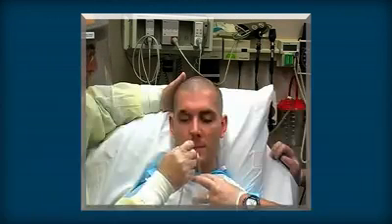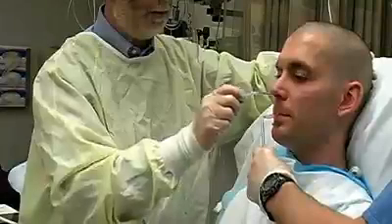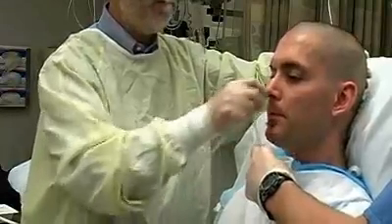This fluoroscopic view shows the tube in proper position in the back of the throat, ready to advance. Have an assistant hold a cup of water with a straw for the patient. Tell the patient to begin to swallow the water and carefully coordinate advancement of the tube with swallowing so that the patient in effect swallows the tube. Rapidly insert the tube to the predetermined depth.